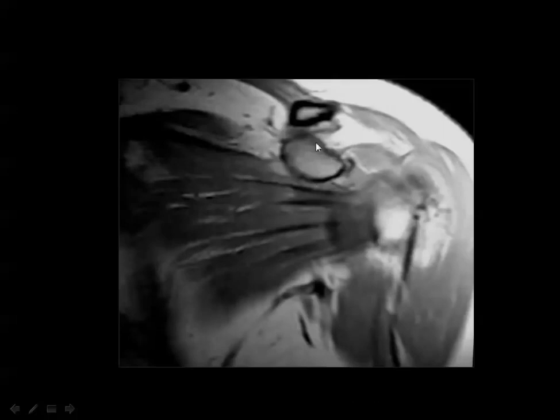And here is the coracoid process, and this is the subscapularis muscle. This is the tendon of the subscapularis muscle inserting into the lesser tuberosity, and this is the tendon of the long head of the biceps going through the bicipital groove.